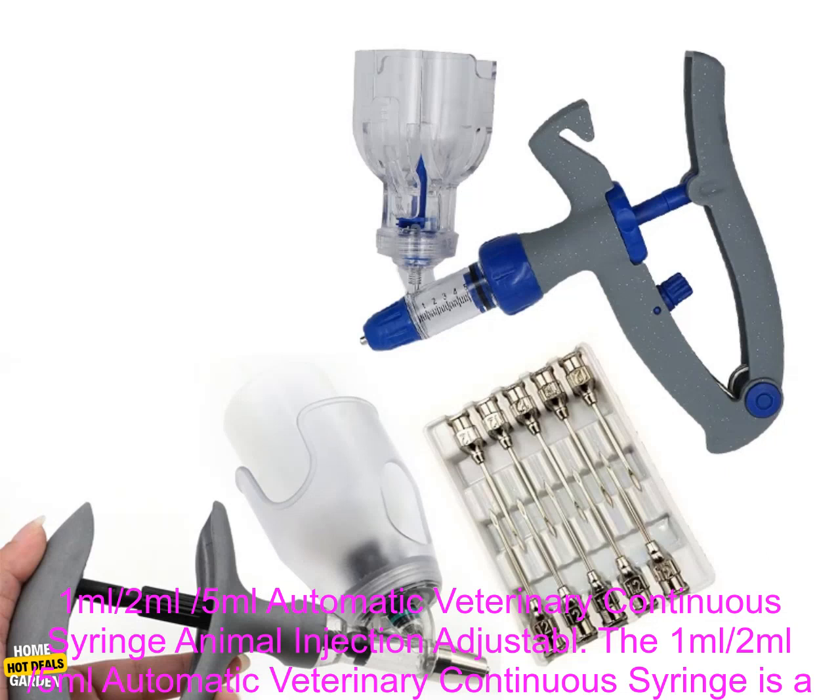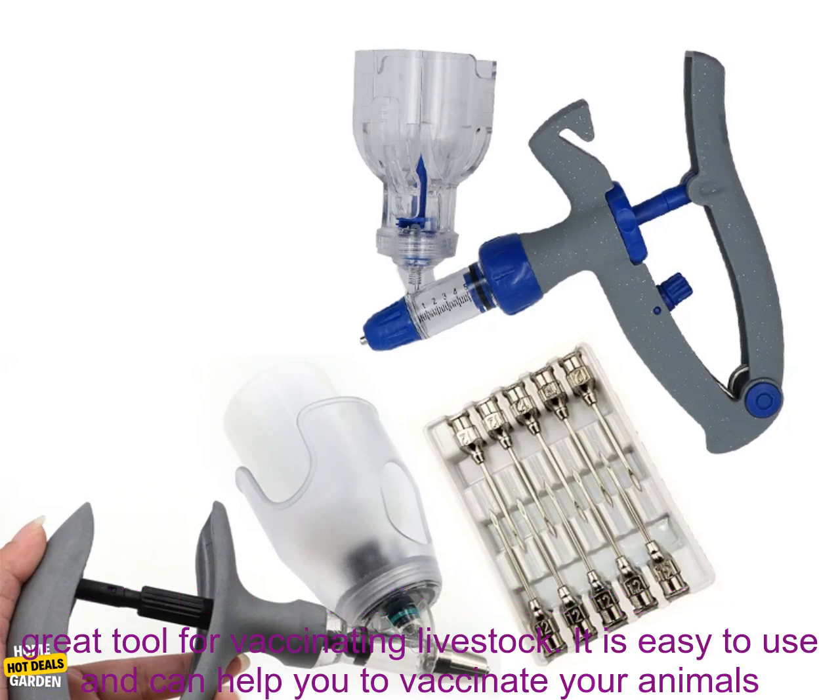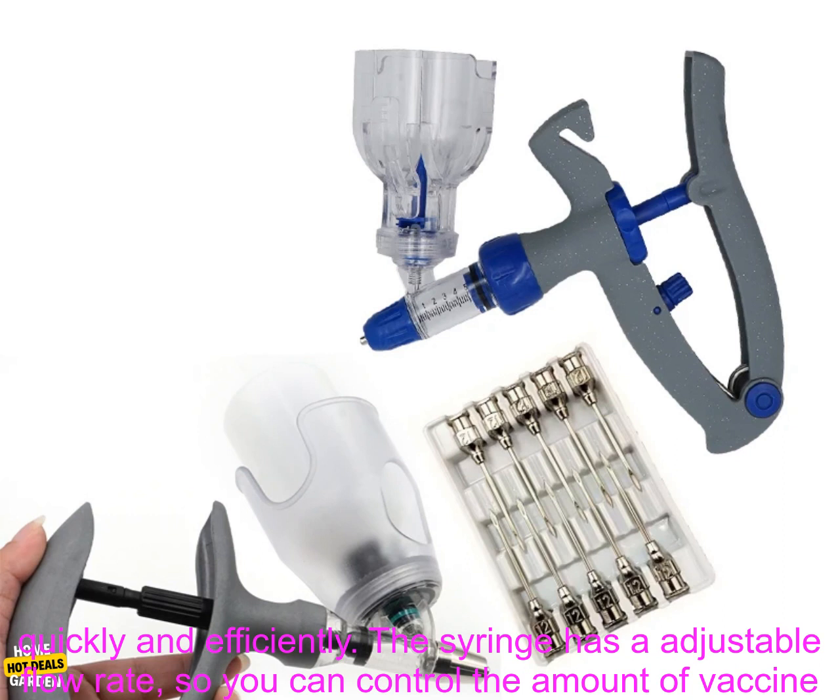The 1 milliliter, 2 milliliters, 5 milliliters automatic veterinary continuous syringe is a great tool for vaccinating livestock.